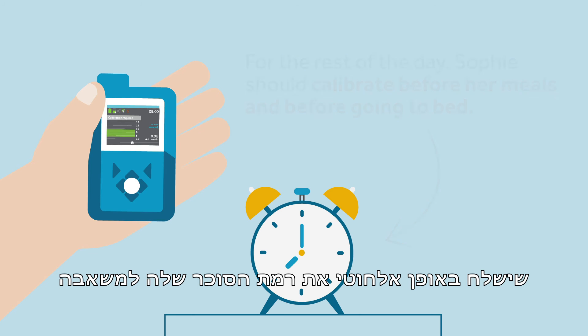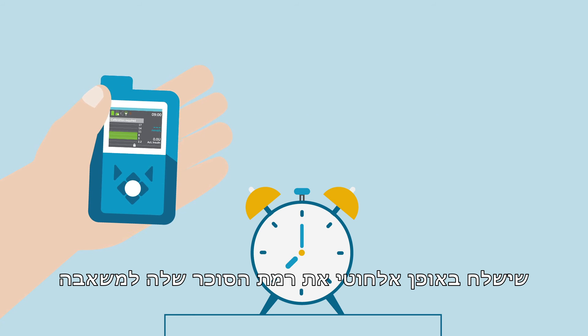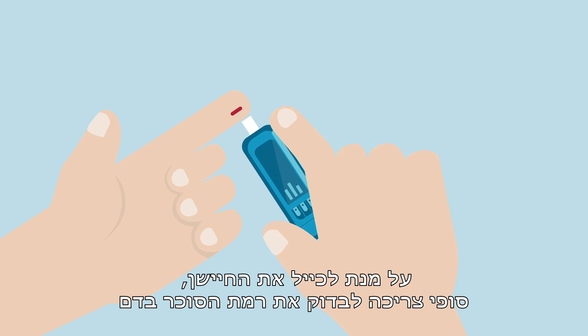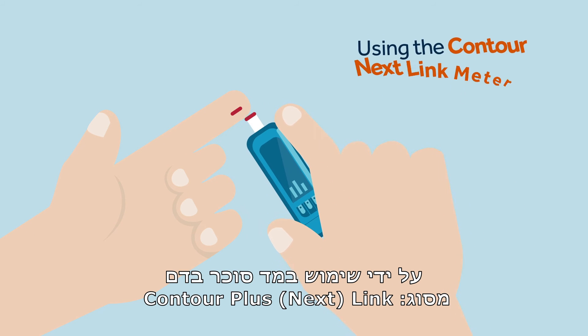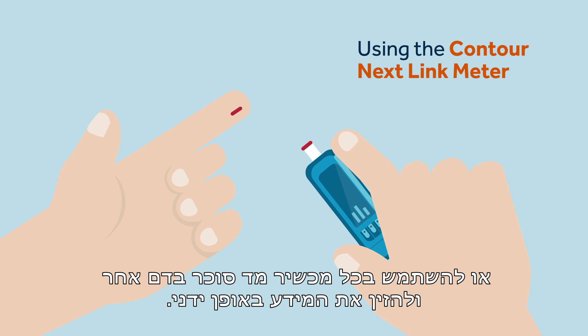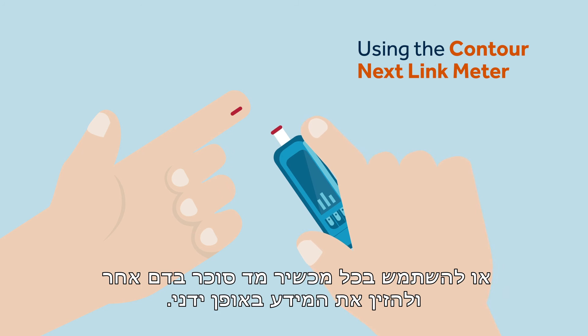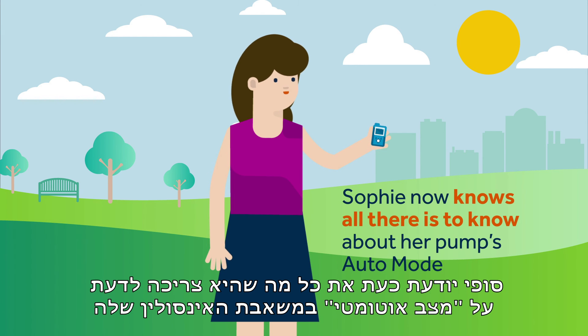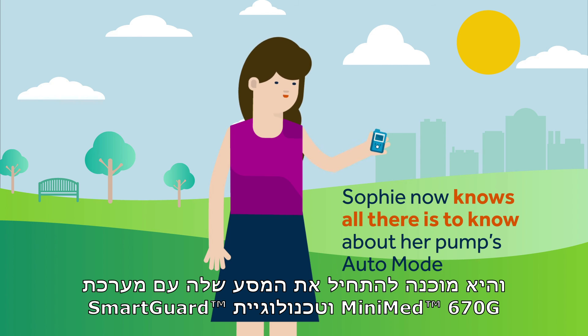Sometimes the pump will ask for an additional calibration to be on the safe side. To calibrate the sensor, Sophie has to test her blood glucose by using the Contour Next Link meter to wirelessly send her glucose level reading to the pump, or using any meter and manually inputting the data. Sophie knows that for consistent results it's best to use the same meter. Sophie now knows all there is to know about her pump's auto mode and is ready to start her journey with her MiniMed 670G system with SmartGuard technology.